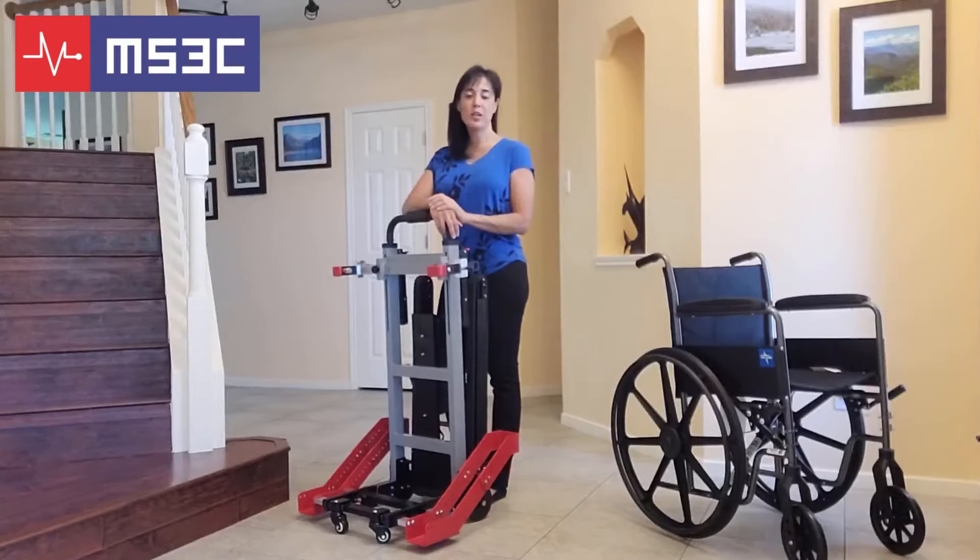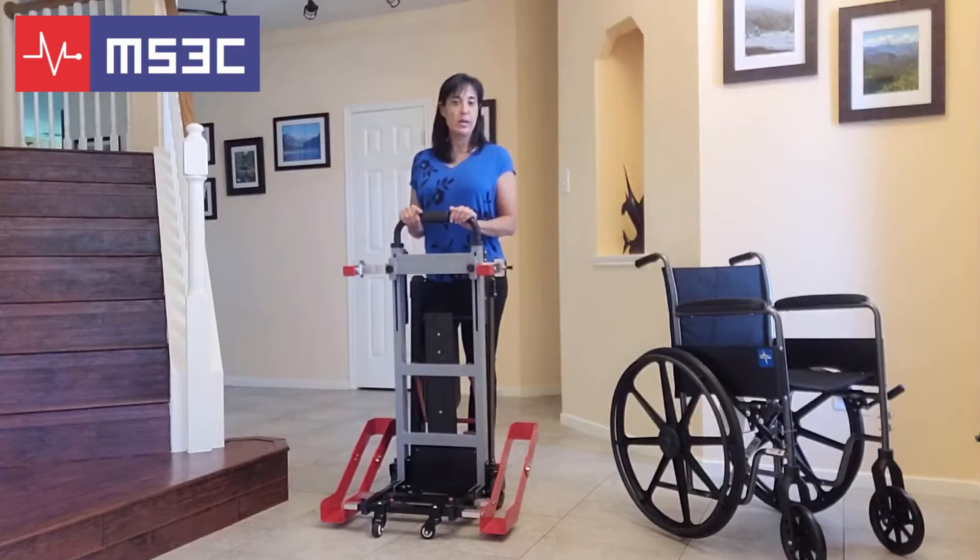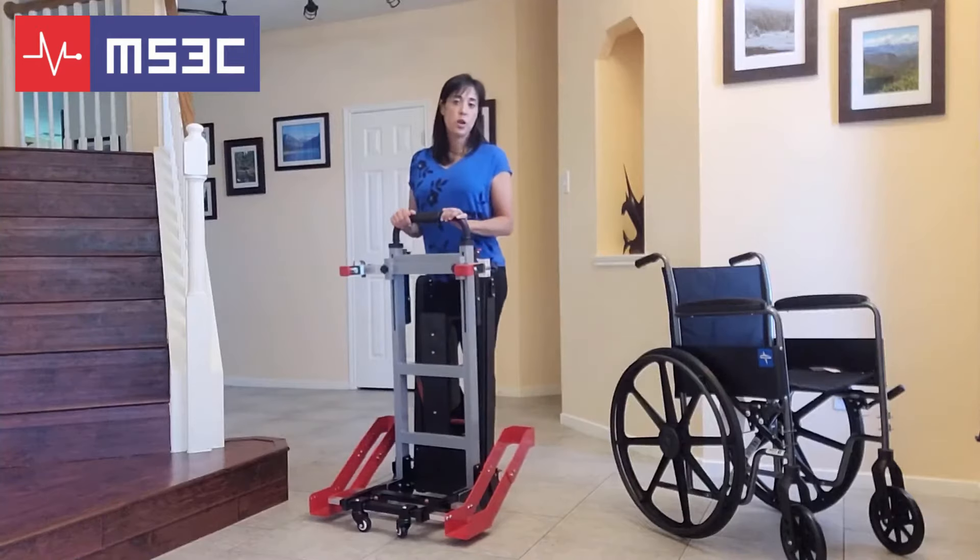Hi guys. Today we're going to walk you through the basic steps and installation process of the MS3C-300WC, our battery operated wheelchair trolley. The MS3C-300WC is going to arrive in a crate. Some of the parts you're going to need to install. I'm going to walk you through that process now.